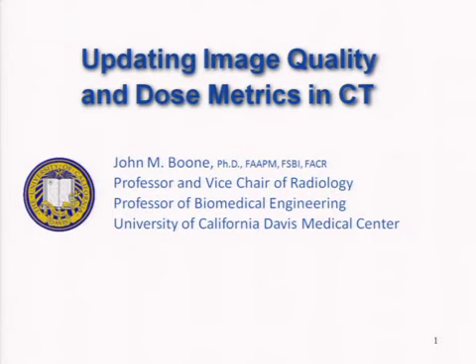And I was at a dose conference that had the title Towards the Submillisievert Examination that was put on with the NIH and FDA. Diana was there, and perhaps some of you as well. And they were talking about a dose report, and Jim Thrall, who's the chairman of radiology at MGH, was advocating an order entry process so when a referring physician orders a scan, it pops up and says, do you realize the patient had a CT scan last night and yesterday morning, and things like that. And those are probably good things. We, the radiology community, need to do the right things to keep the doses down.